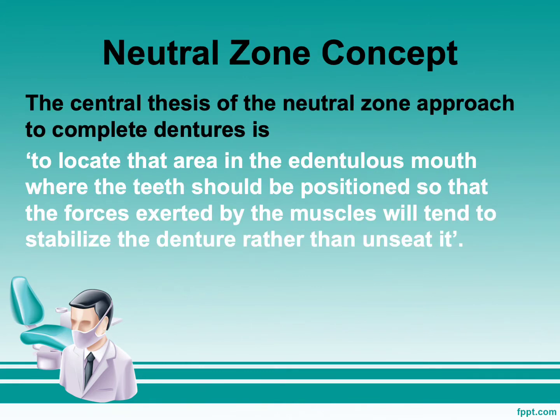Neutral zone concept. The central thesis of the neutral zone approach to complete denture is to locate the area in the edentulous mouth where the teeth should be positioned so that the forces exerted by the muscles will tend to stabilize the denture rather than unseat it.